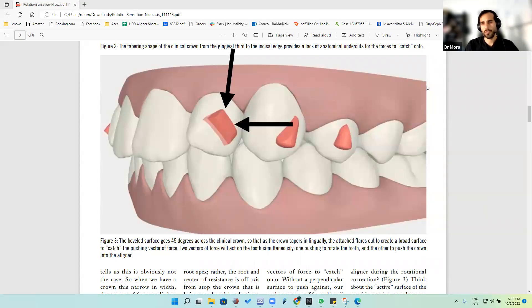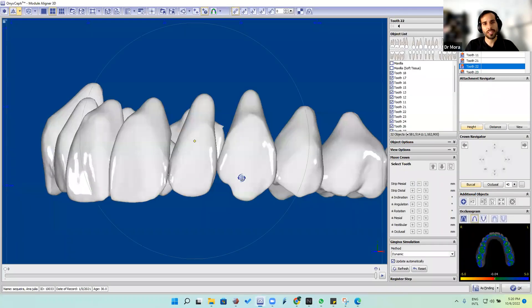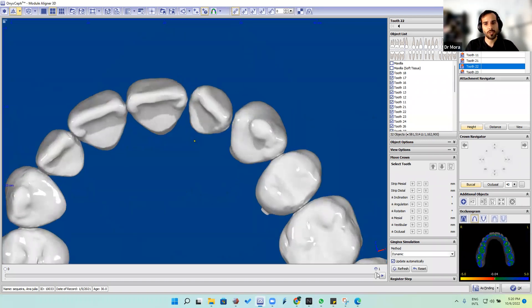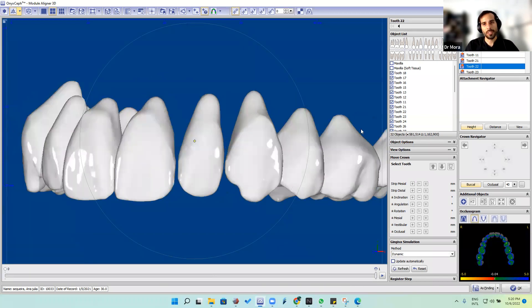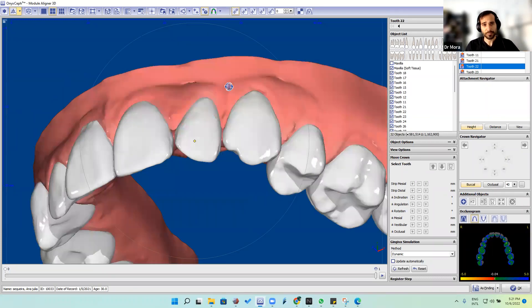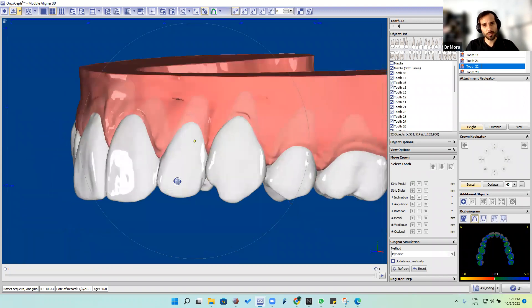Hello guys, welcome to another video. This is Dr. Mora again. Today we're going to see how to make a sash attachment on OnyxCeph for clear aligners. We already have one attachment in the OnyxCeph software. Let's assume this lateral is not rotated — I made it on purpose — but the important thing here is which attachment we're going to pick.